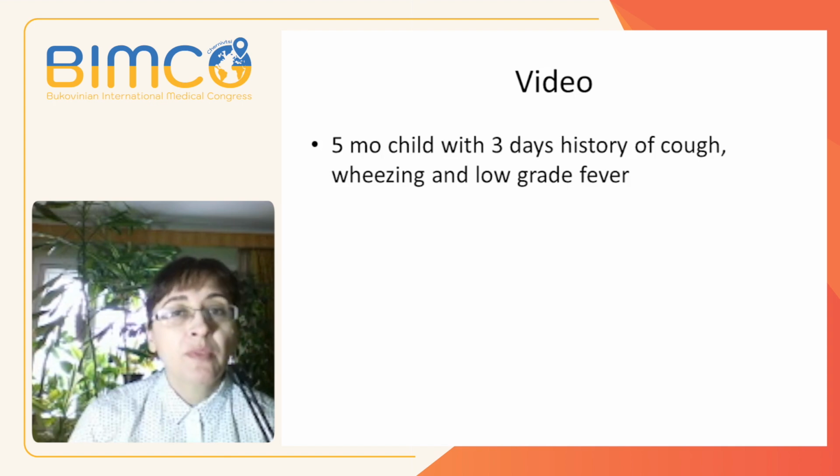Now, dear colleagues, we will observe a video of a 5-month-old child with a 3-day history of cough, wheezing and low-grade fever.